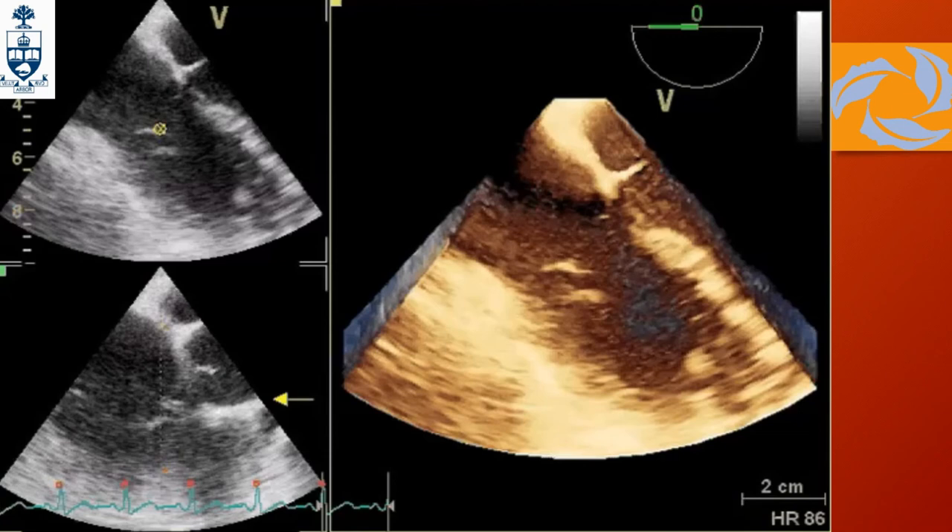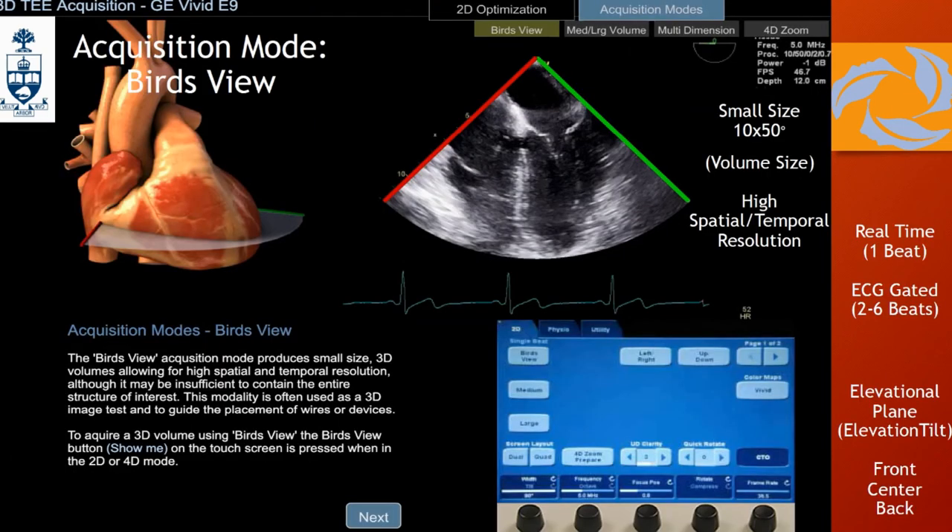To get a better frame rate, you go from one beat up to two, three, four, or six — six is the maximum recommended by ASE 3D guidelines, with four beats recommended as the target for better quality. This is an important functionality to be aware of. The bird's view gives you this type of image — it won't ever include the whole RV, but for data assessment or at least a 3D impression, it's pretty handy.